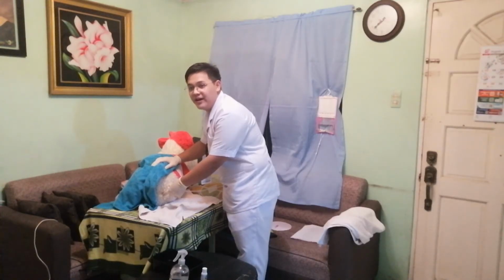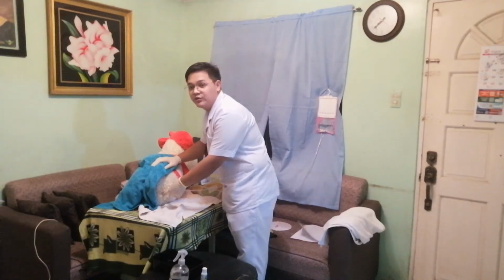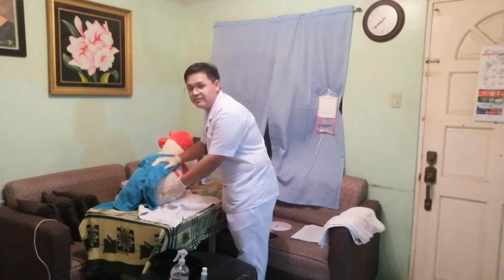And if we're doing a high enema, we need to hang or hold the solution container about 45 centimeters or 18 inches away from the rectum.